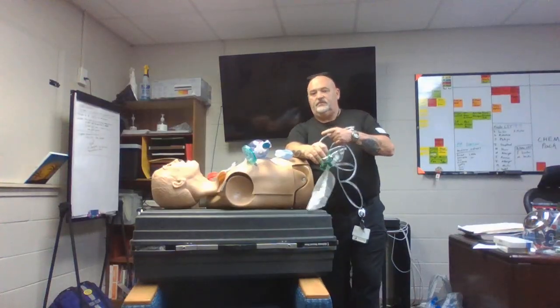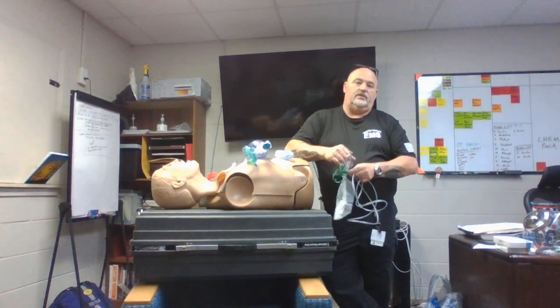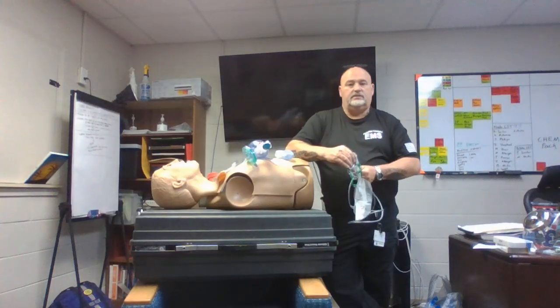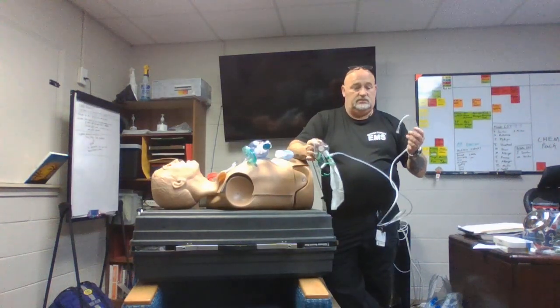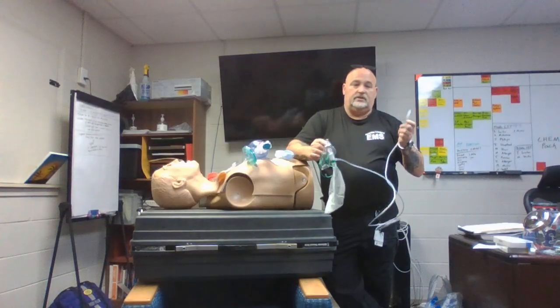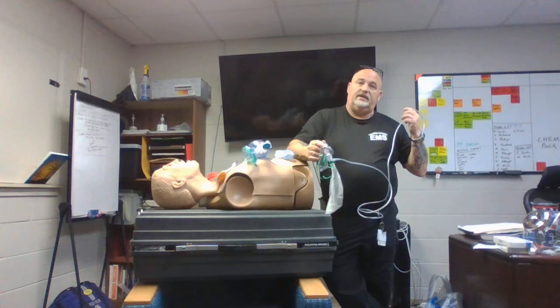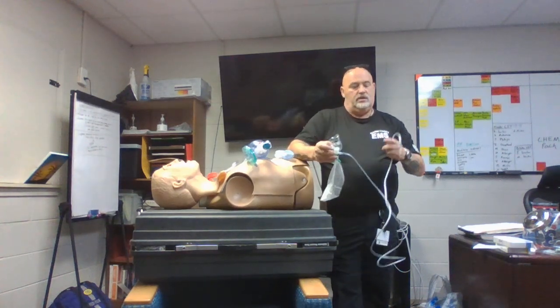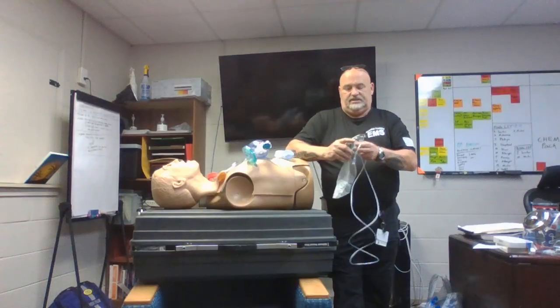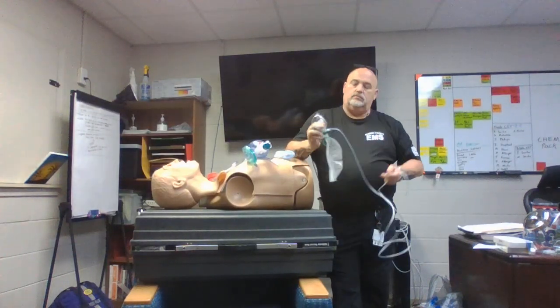We talked about the flow rate for that nasal, right? We said anywhere from a half a liter to 6 liters. Okay, we're going to take this. I like to start these no less than 8 to 10 and run them to 15 as needed. But before we do that, you know, we hook it all up. We're not going to just put this on the patient's face, right? You want that reservoir bag full.